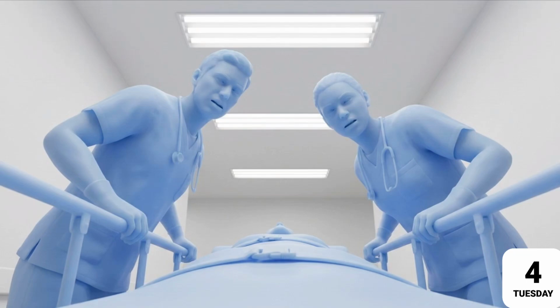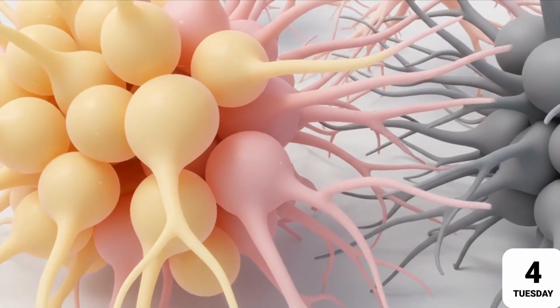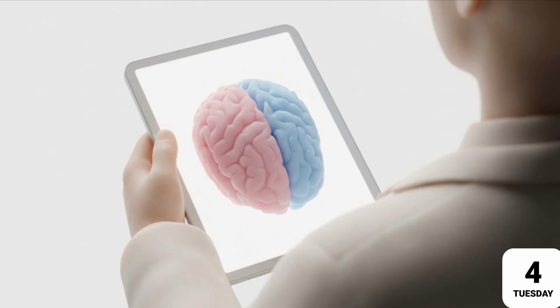A patient is rushed through the ER doors. They can't speak, and one side of their body is completely paralyzed. The clock is already ticking. Deep inside of the patient's head, millions of microscopic brain cells are rapidly suffocating. The medical team faces an immediate fork in the road.